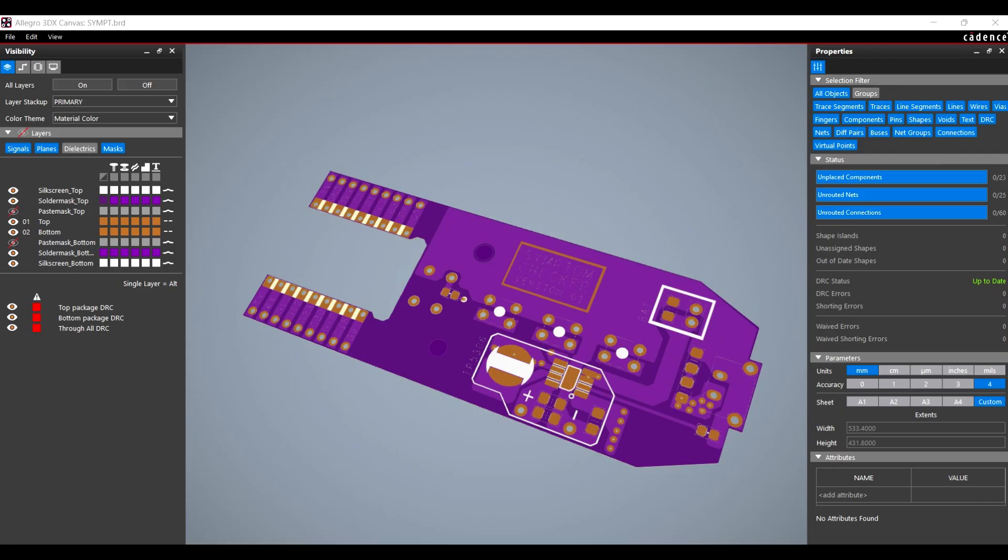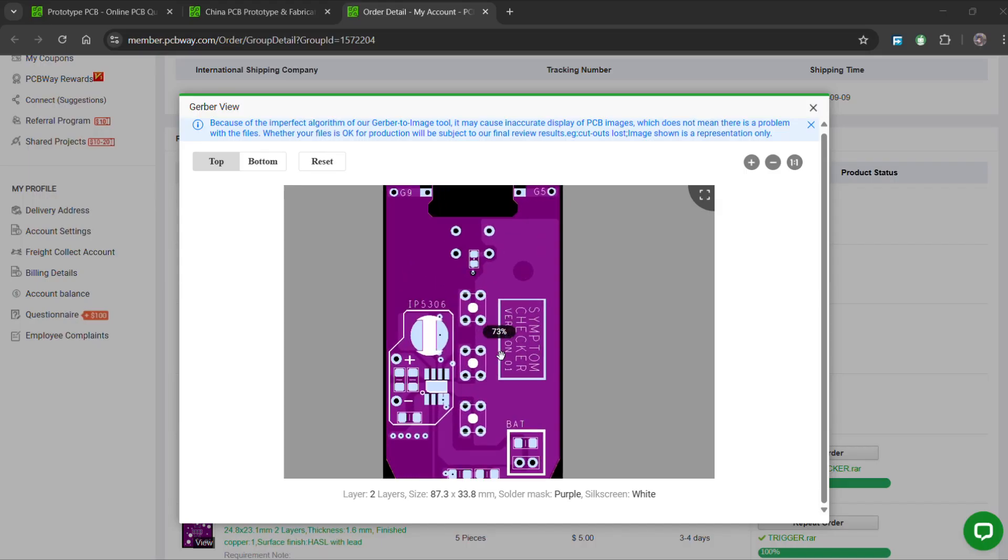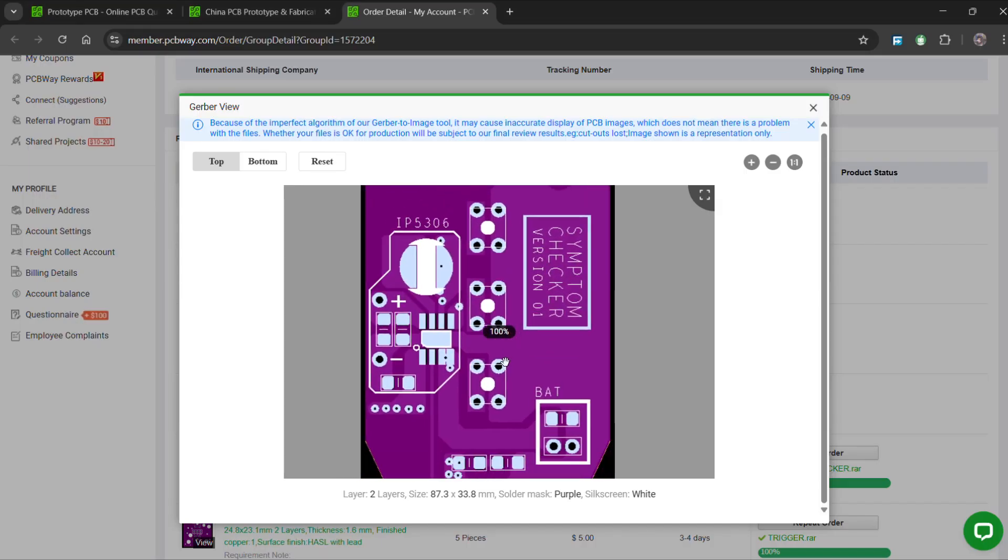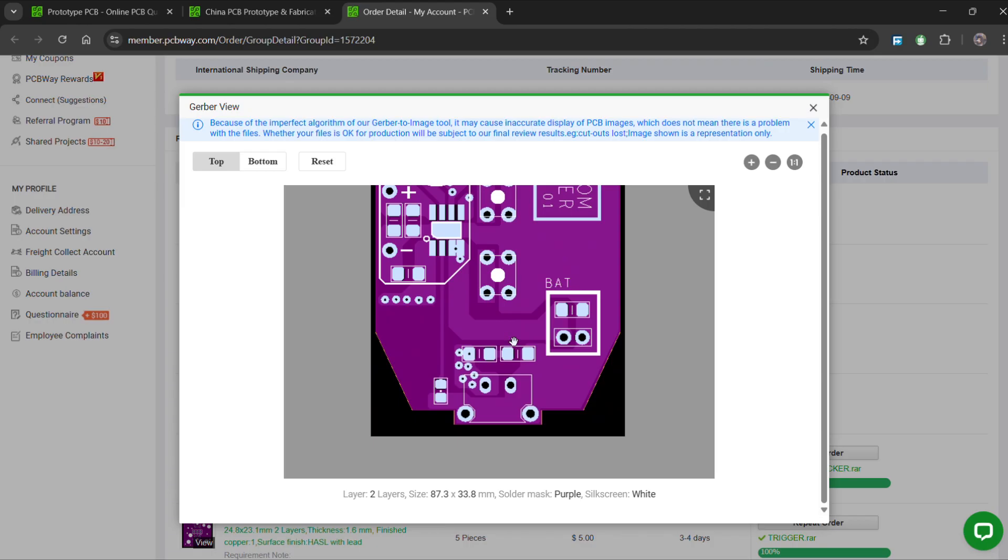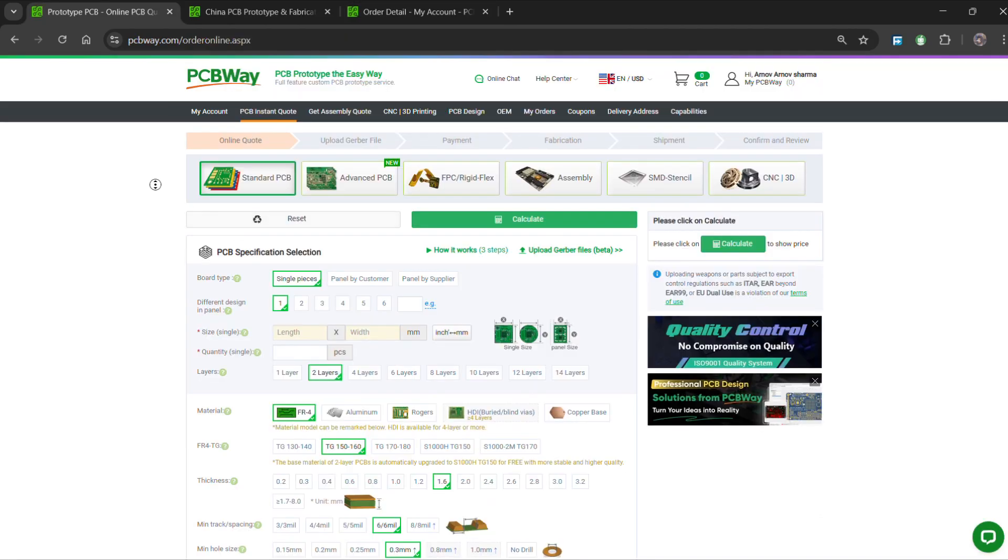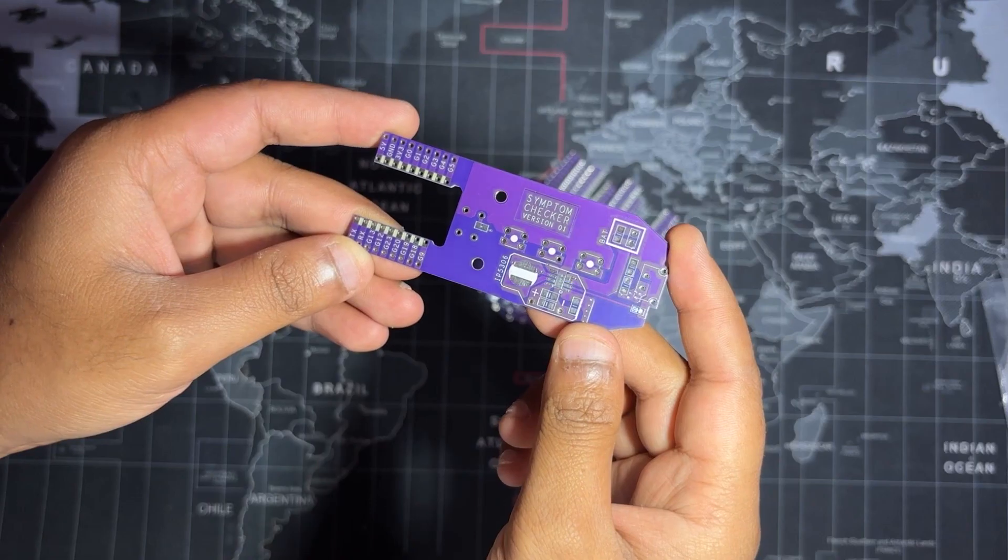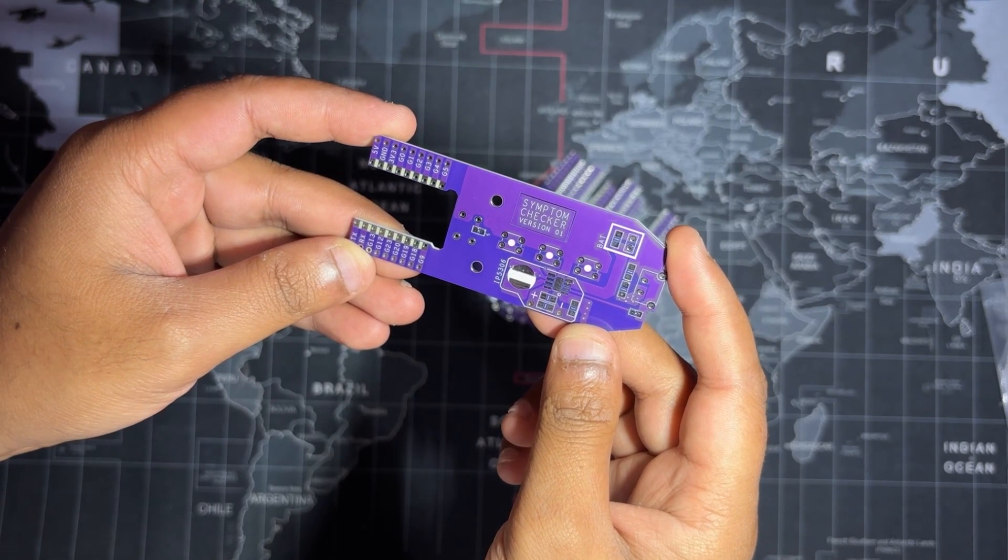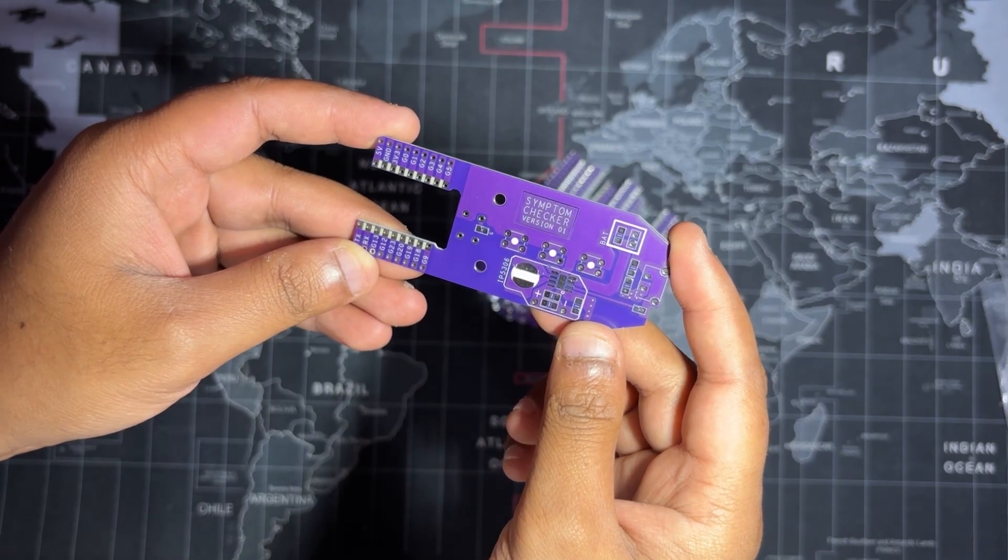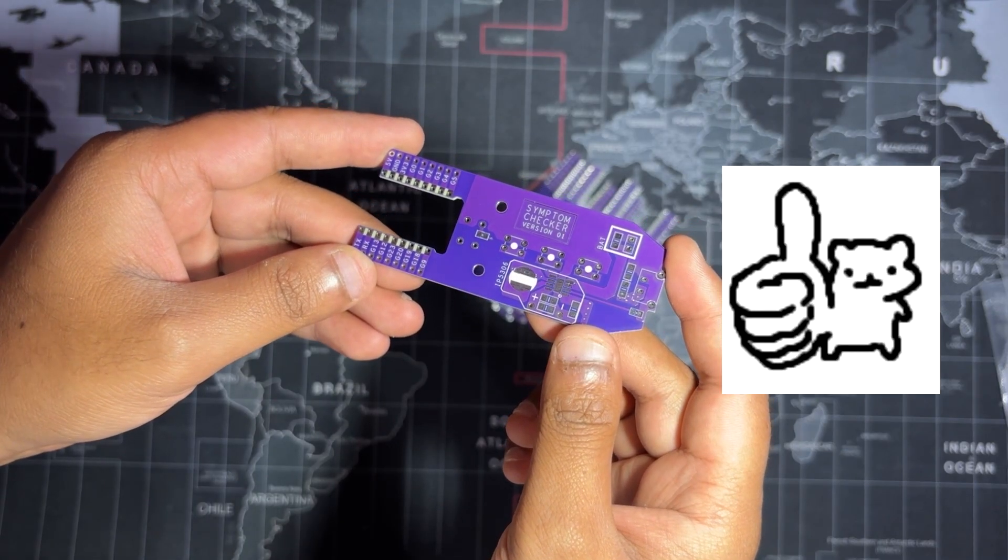Once the board design was finalized, we placed an order in purple solder mask with white silkscreen and uploaded the Gerber data to PCBWay's quote page for fabrication. The PCBs were received within a week, and the PCB quality was excellent.